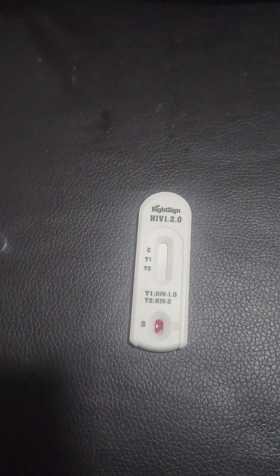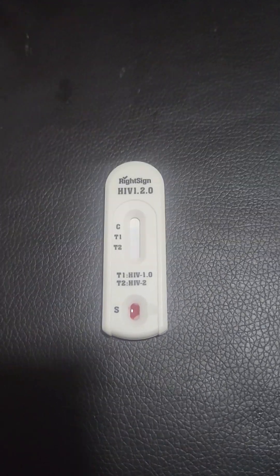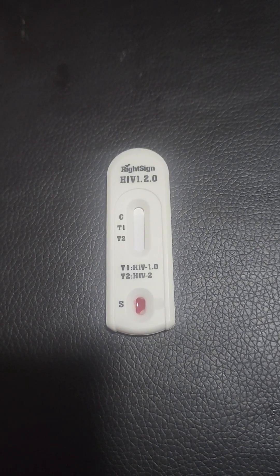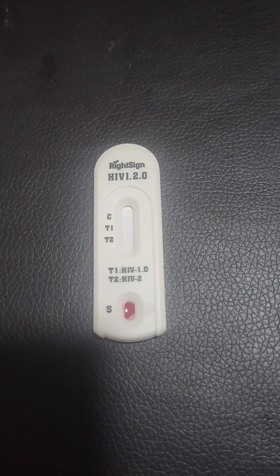After adding the buffer solution, you will then wait for five minutes. You should observe the solution enter the test kit.